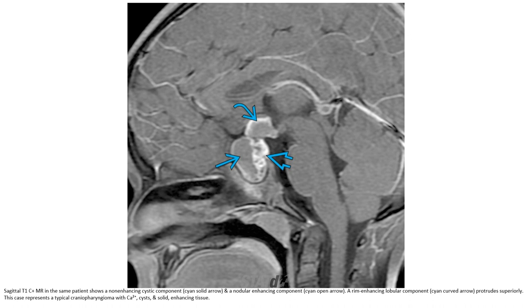Gadolinium-contrast MRI in the same patient shows a non-enhancing cystic component and a nodular-enhancing component, with a rim-enhancing calcified component superiorly. This case represents a craniopharyngioma with calcification and solid-enhancing tissue.